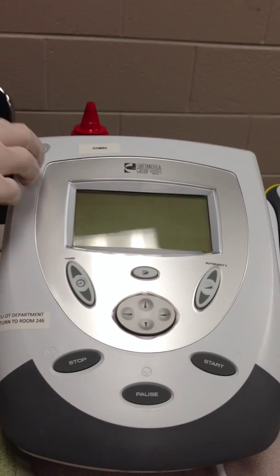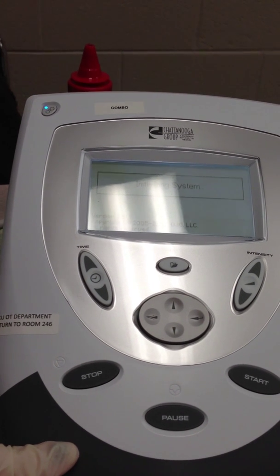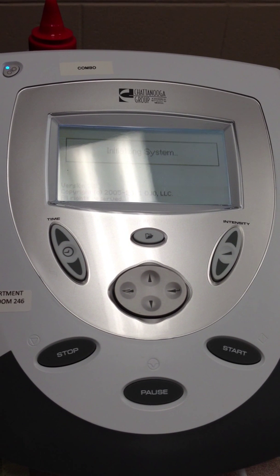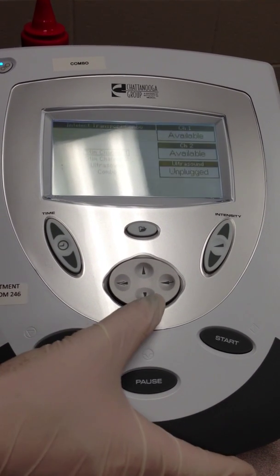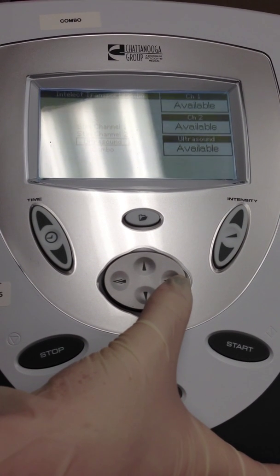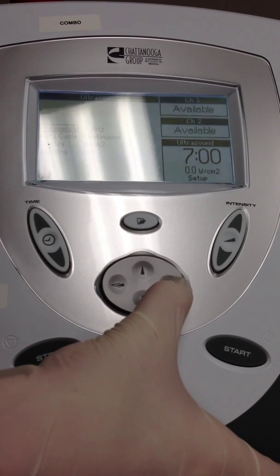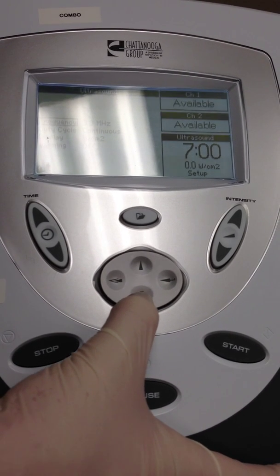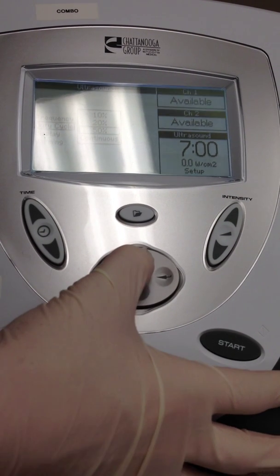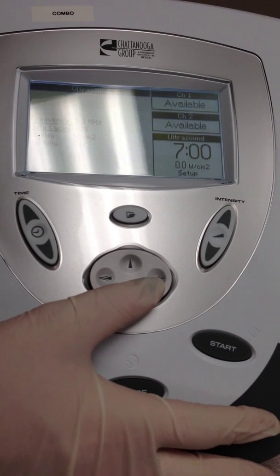So to start out, we're going to turn on the machine. We're going to select ultrasound. We're going to change the frequency to 3 and the duty cycle to 10%. We're going to keep the warming off.